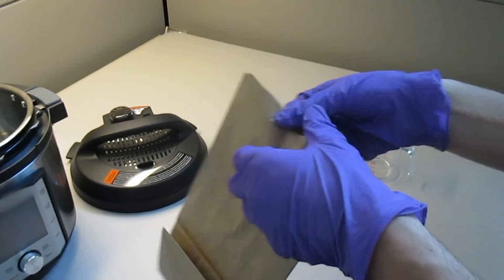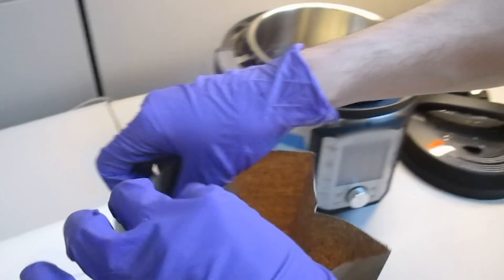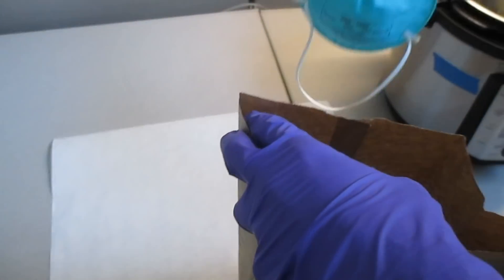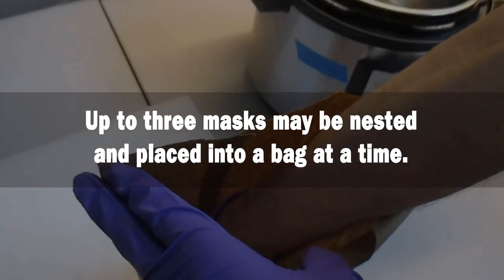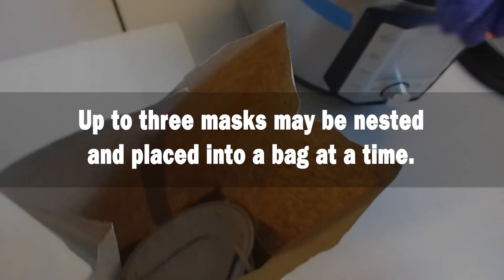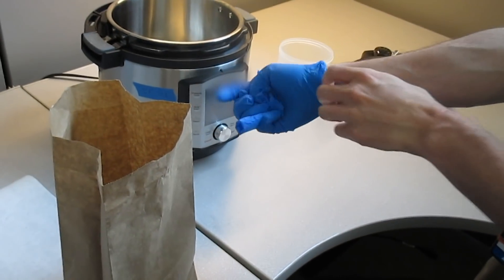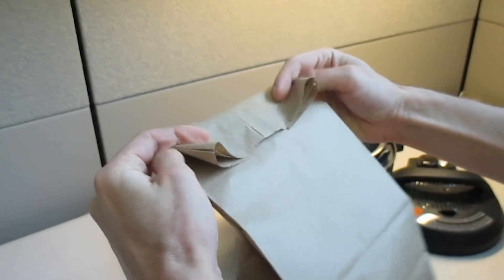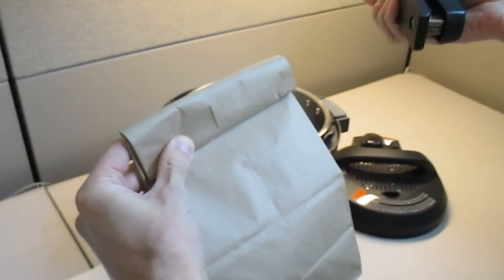Put on your gloves. Open the paper bag to allow the mask to be placed inside. It is best to handle the mask with one hand and place it inside the bag. Once the mask is in the bag, remove the gloves and discard them safely. Fold over the top of the paper bag and secure it closed with a staple or paper clip.